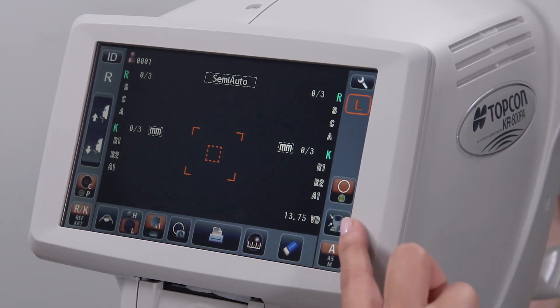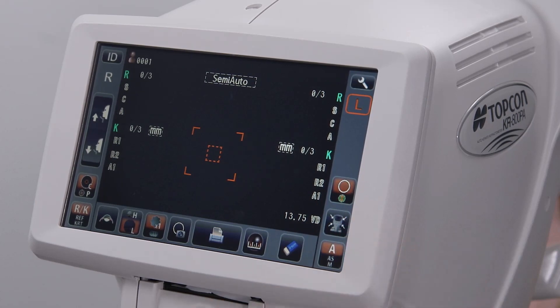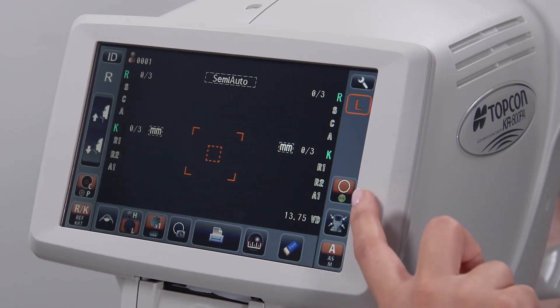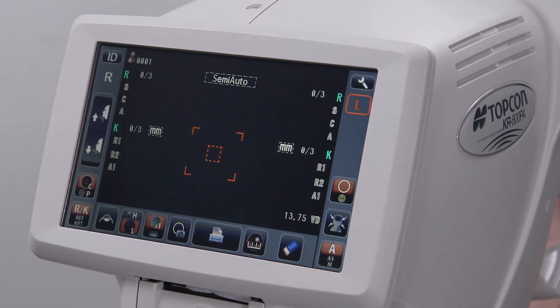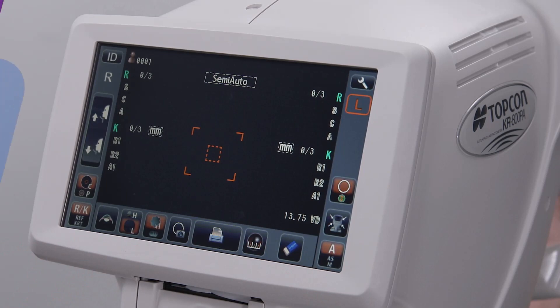The position reset icon moves the measurement head to its default position to be ready for the next patient or to shut down the device. The corneal mapping icon allows the operator to turn the corneal mapping feature on or off. The rest of the icons are common to all KR models, as are explained in a separate video.